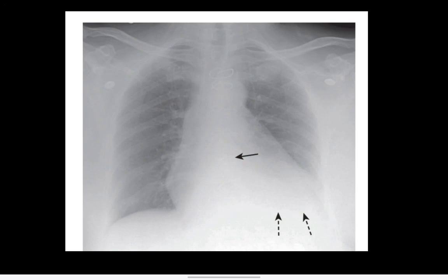Time's up. Okay, you are right, this is an anterior posterior radiograph because the cardiac contour is very large and the inspiration is diminished.